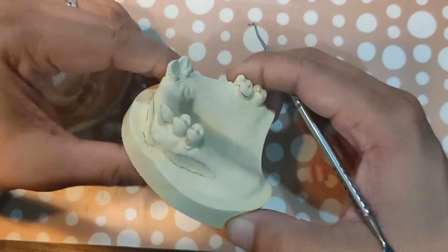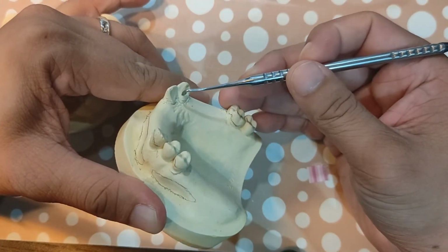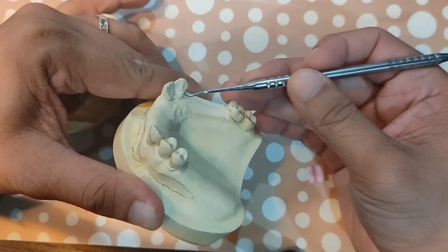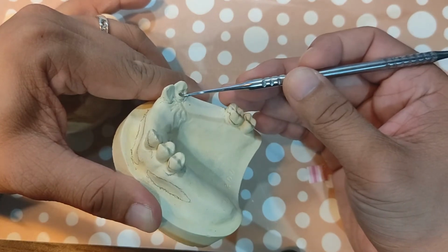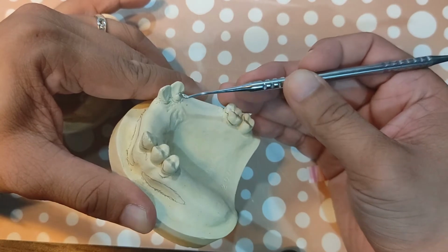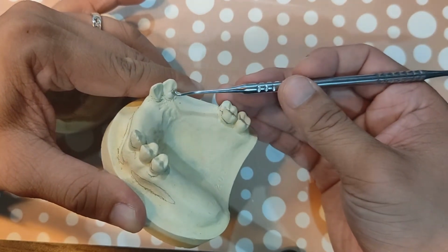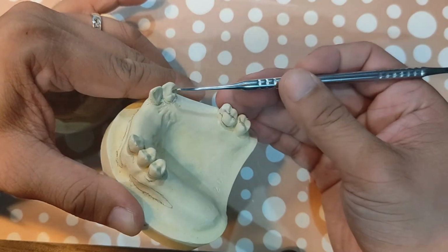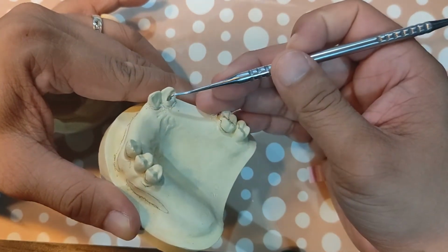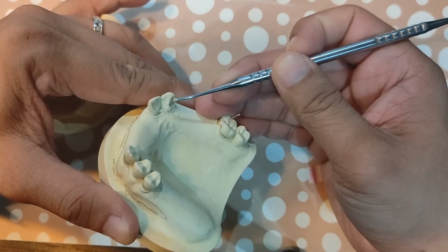Okay. You have to angle your cleoid in such a manner that you reduce it from the incisal, ha? Hindi pa ganon. Because if you try to make cingulum rest seats na your cleoid carver is pointed perpendicular to the lingual slope, you're going to create a roof. No? It has to be a bit directed towards the axial of the canine.